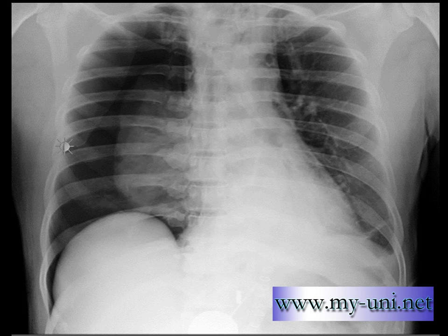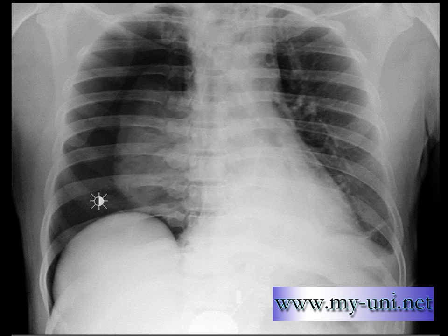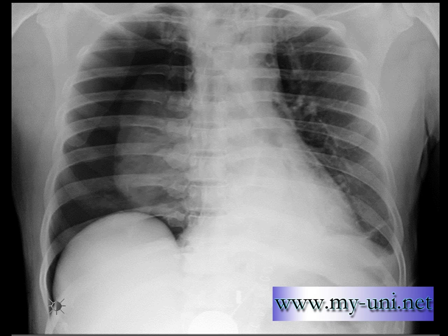They need to put in a chest tube urgently and try to remove this air from the right pleural cavity so the lung can expand again and start functioning. Keep this hemidiaphragm shape in mind — I'll show you a normal chest X-ray so you can differentiate how a normal hemidiaphragm should look compared to this one.